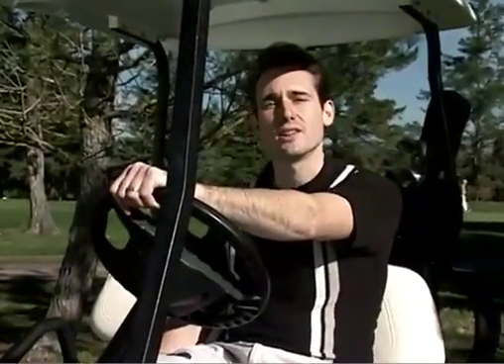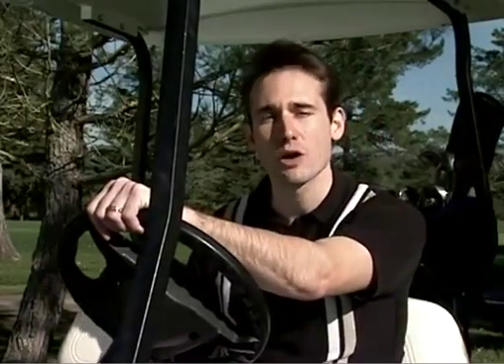After learning I could have dental implants, I still had some questions. Before going ahead with surgery, I wanted to make sure that I understood what the treatment involved. I read all the literature that my oral surgeon gave me and wrote down my concerns so that I could go over them in detail with the dental implant team.